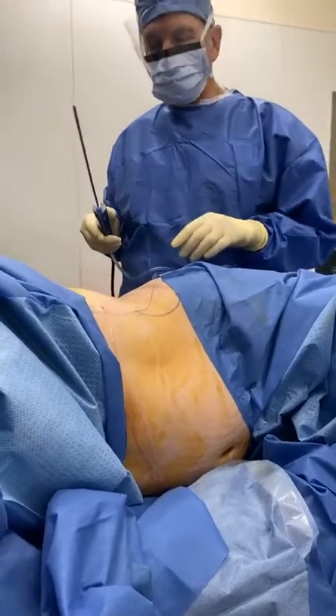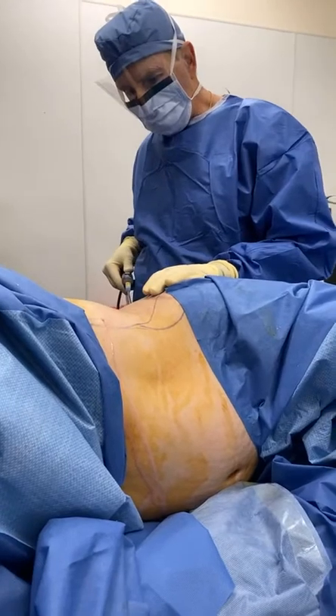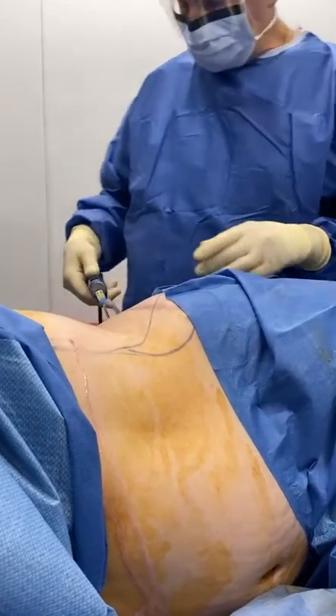Good morning, Dr. Patina here at the Cosmetic Surgery Center of Posterito. We're going to do liposuction on this patient, and we're going to do laser-assisted lipolysis, and we're just going to go ahead and turn on the machine.